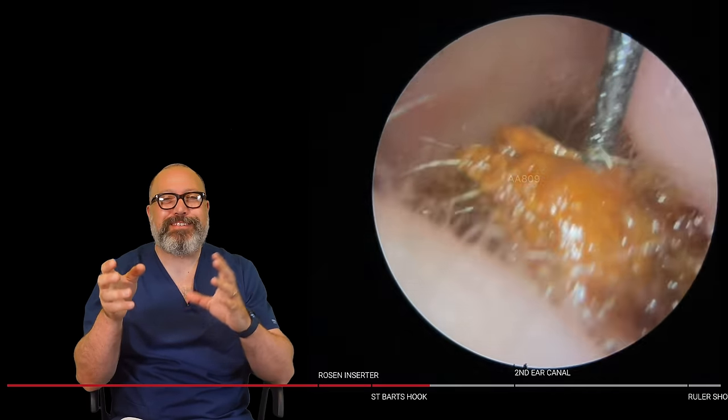So let's get rid of this little bit of dead skin at the base of the canal. You can see how the skin comes away there. Look at that whole section that was sitting at the base of the canal. But let's take a look beyond it. There we go. There's the eardrum. So not going quite as deep on that one, but still a fair size plug.